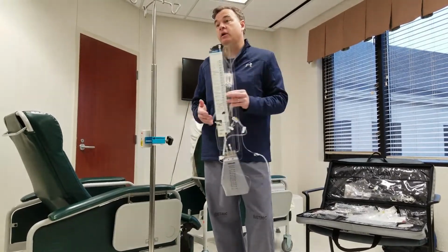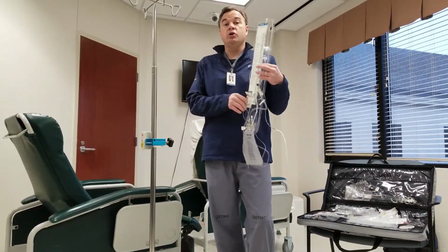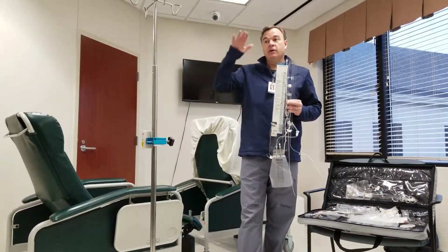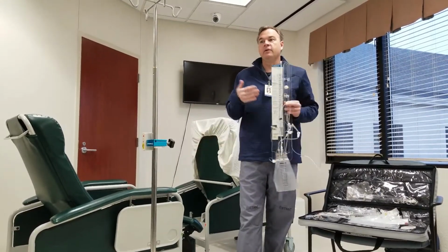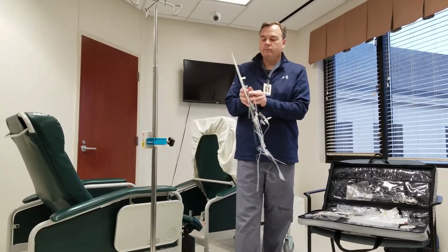If they are ambulatory, the one thing you want to know is if they're going to the bathroom. No matter what kind of drain they have, no matter what's going on, you want to shut it off before they stand up. Again, because that gravitational push in the canal can cause extreme headaches. It's a risk for falling. Just be aware that standing up is not something that you want to take lightly with a lumbar drain.